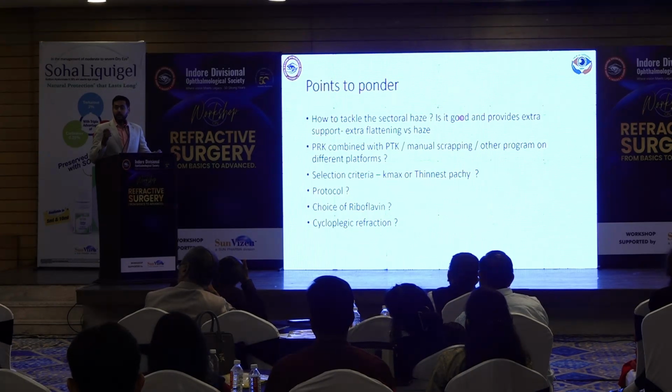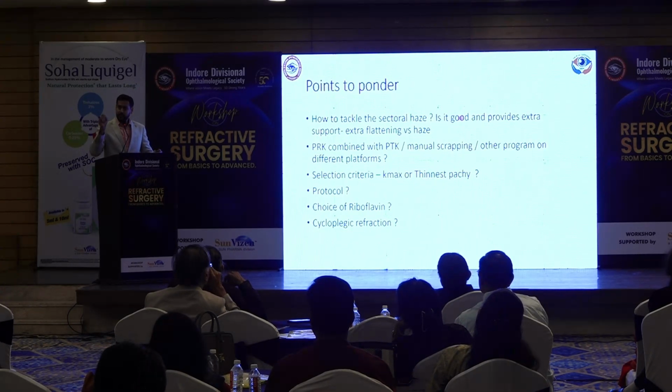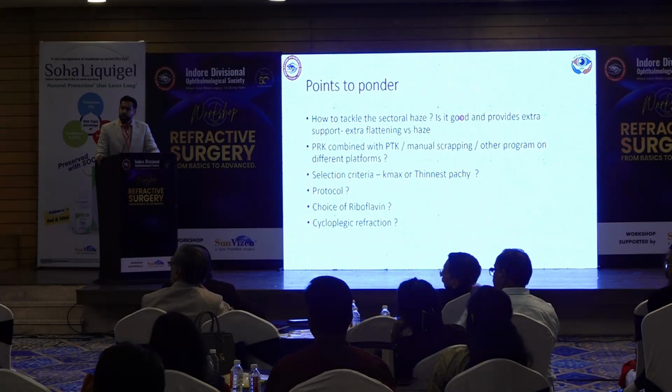So the question I meant to ask was whether we should start our criteria more deliberately into the moderate to severe keratoconus and just give very minimal burn so that they may produce haze, which will give us a flattening thing, or should it not?